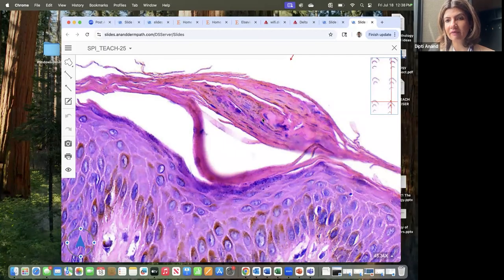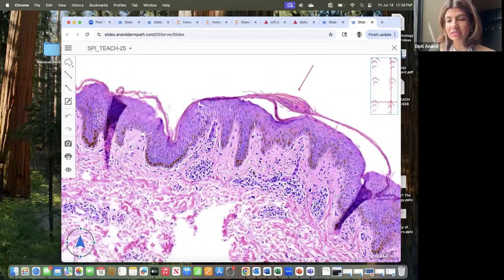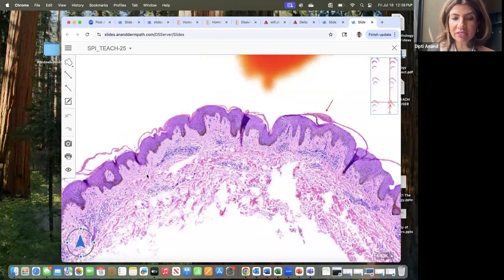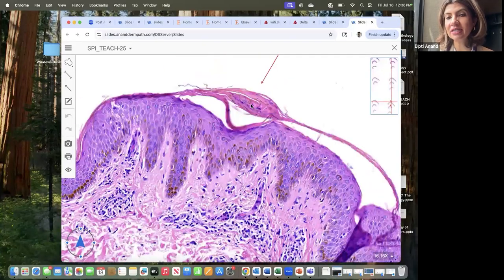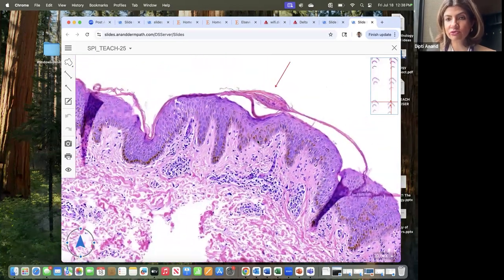So you see the parakeratosis, the nuclei, but no neutrophils. So it's a clean mound, lifted up from the epidermis like the lid of a tea kettle. And you can see that the inflammation is just superficial perivascular. You may have a couple of eosinophils, but it should not be a whole lot of inflammation going into the deep dermis. So that's pityriasis rosea. Delicate pityriasiform spongiosis. The background pattern is undulating epidermal acanthosis, so not a very thick epidermis. But most importantly are these clean mounds of parakeratosis lifted up from the epidermis like the lid of a tea kettle, with a superficial perivascular infiltrate. Okay, so that is pityriasis rosea.